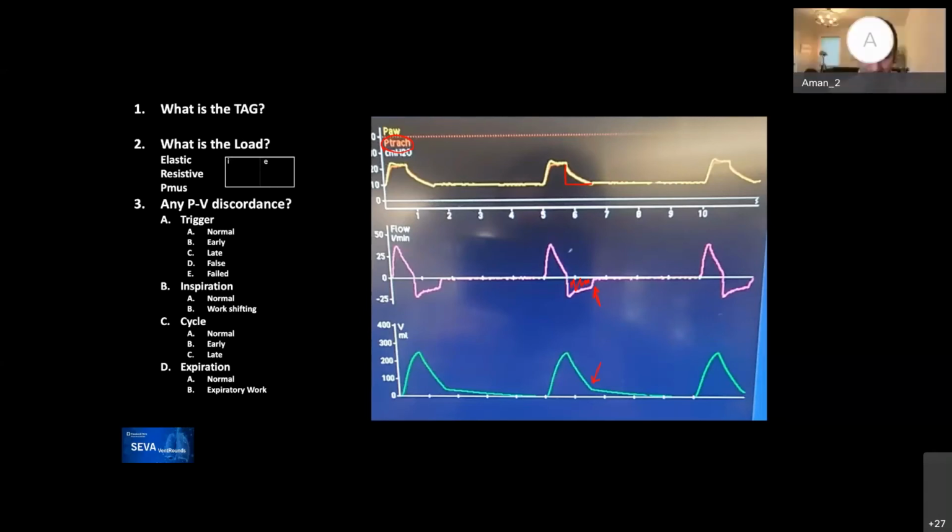So Matt, just to clarify, if I'm hearing this correctly, initially there is some resistance offered by the expiratory valve. That's why you have that gradual decay of airway pressure. But then when it reaches the set PEEP, that's when the valve closes down totally. Well, I'm not sure if it closes totally.